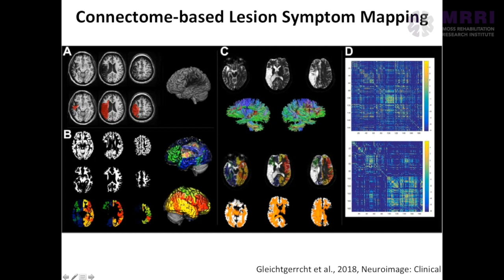And then you can typically represent it in terms of these heat maps, where, let's imagine you have 100 regions in an atlas. You'll have warped your stroke participant's brain to that atlas. You'll have then warped their structural images to that atlas, so that you can look at region by region connectivity or disconnection in patients.